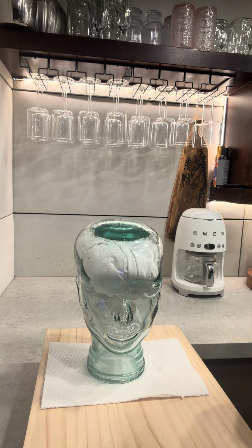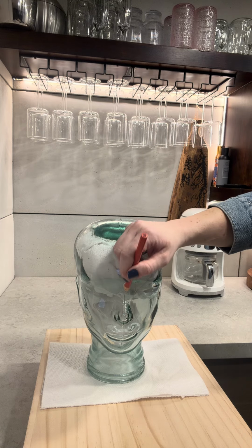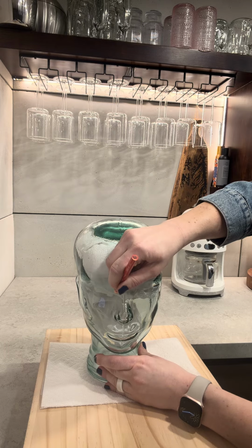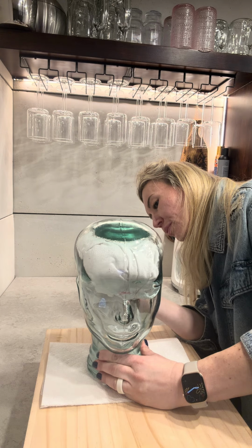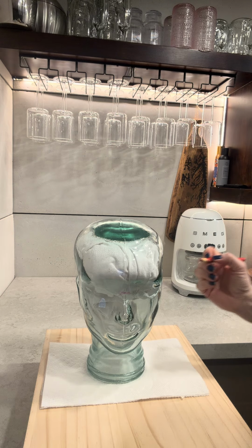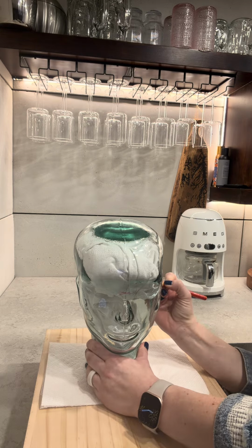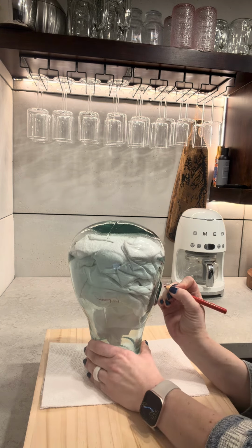Okay, I'm going to start with marking Nasion. Inion. My preauricular points, left side and right side.